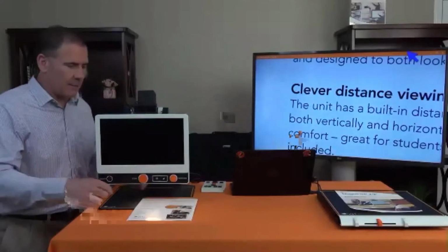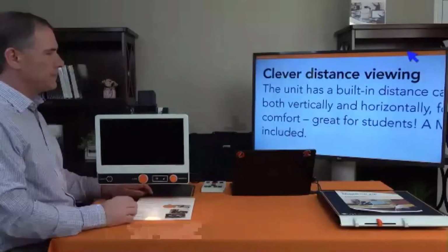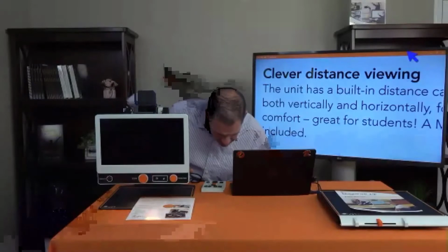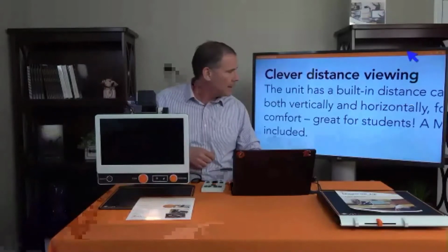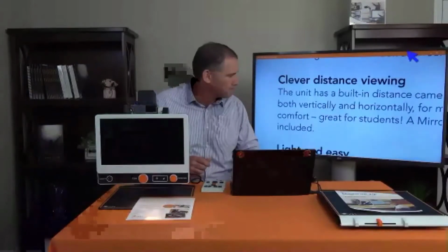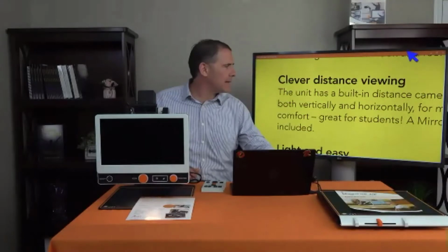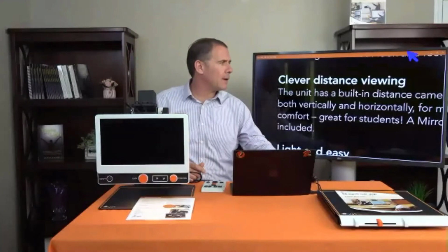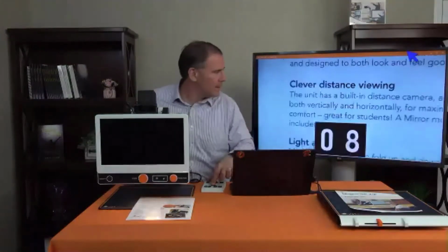And again, I would move my document. You notice it's a little different now because I'm running through the processor of a computer. These buttons do not work. The computer runs it. You would think if I hit the up arrow, down arrow, well, sorry. It would be nice if I hit the right buttons. There. Up arrow, down arrow. If I want to change, I go to my F keys. F1 is color, F2 changes that, F3 changes that. So I can swap between the backgrounds and the foreground changing. And then I hit 1, I go right back to color, I think. I'm going to lessen the magnification a little.